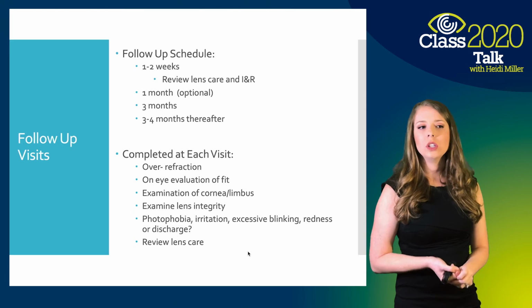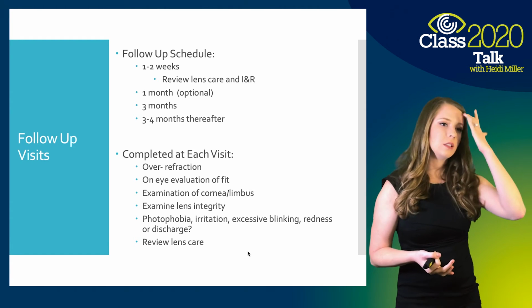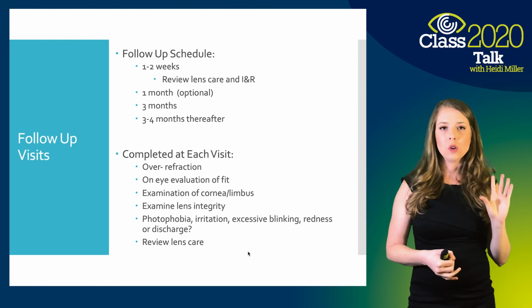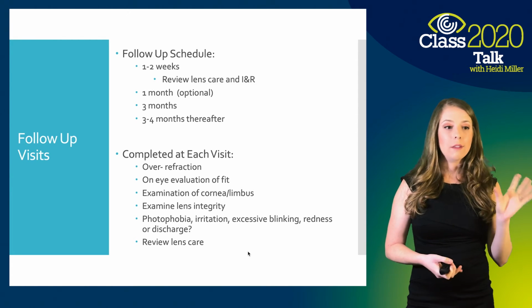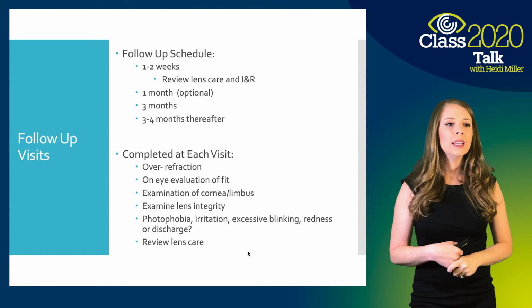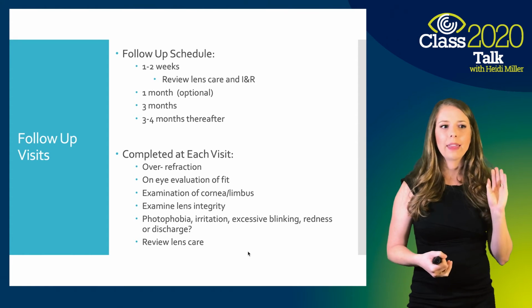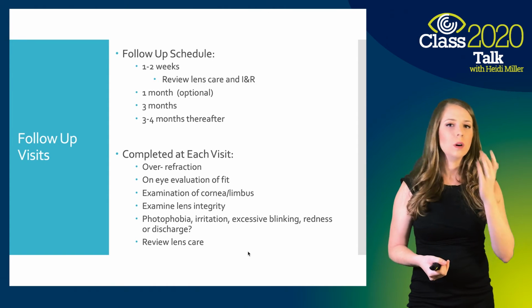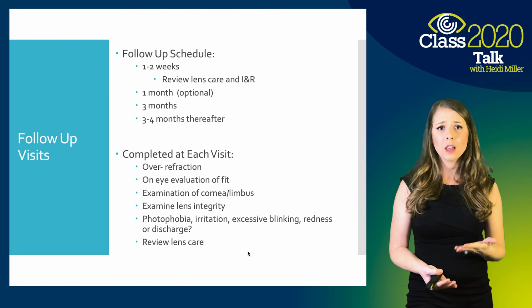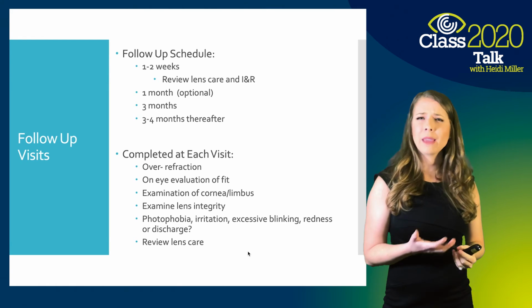Follow-up schedule: you'll see on the initial dispense, you'll see them back in 1 to 2 weeks. Right now with telemedicine, I've been doing a lot of these just over a video visit, just to review solutions, see how they're doing with insertion and removal, and then seeing them back at like a 1 month mark. If you want to see them back in the 1-2 weeks though, that's no problem. It's whatever your comfort level is with that. And I guess patient dependent.